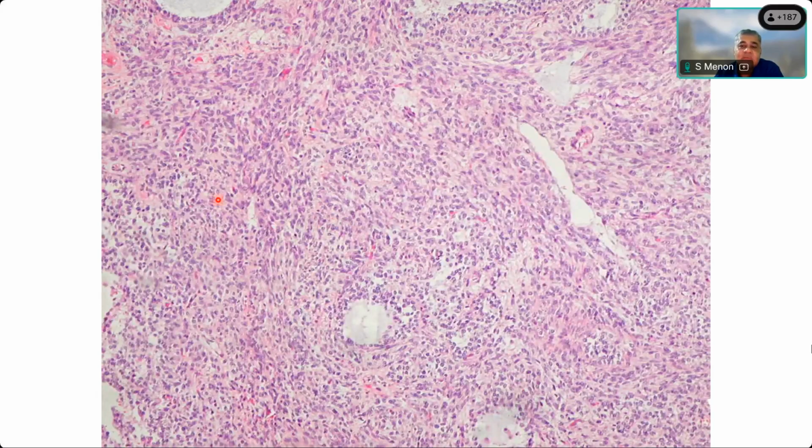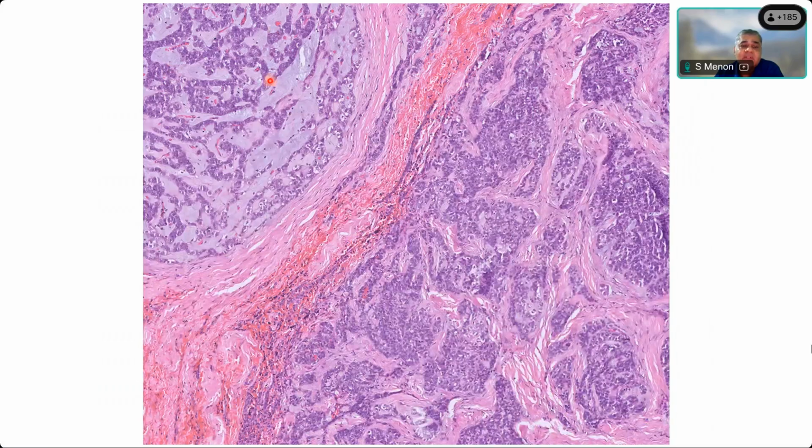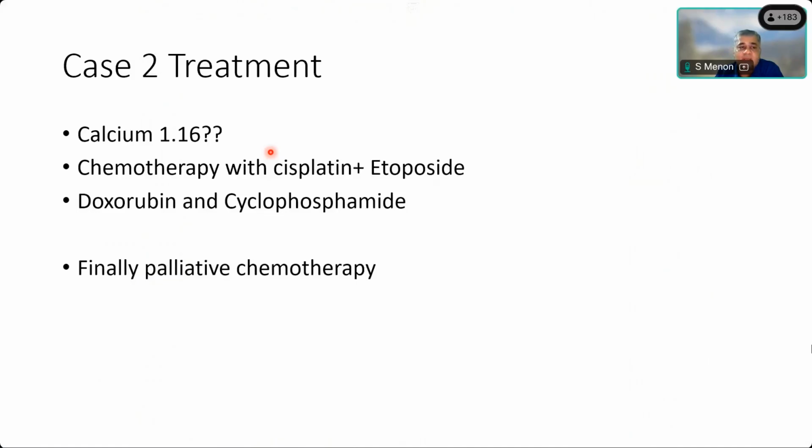Sometimes these granulosa tumors can be very spindly. They can look very pink. They can have a lot of myxoid stroma. They can have these intercommunicating kinds of ridges, which can be there in juvenile granulosa. It is again the age which is important. You have to look at features, and obviously, when you do your IHCs, you will find your diagnosis.